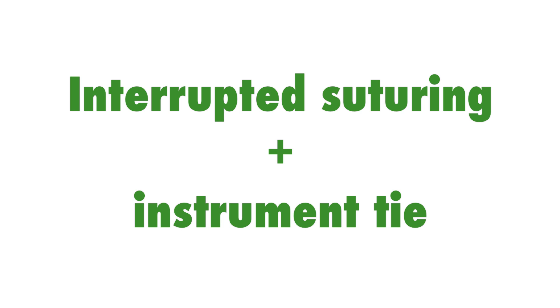Now what we're going to show you here is how to do an interrupted suture and how to do an instrument tie.